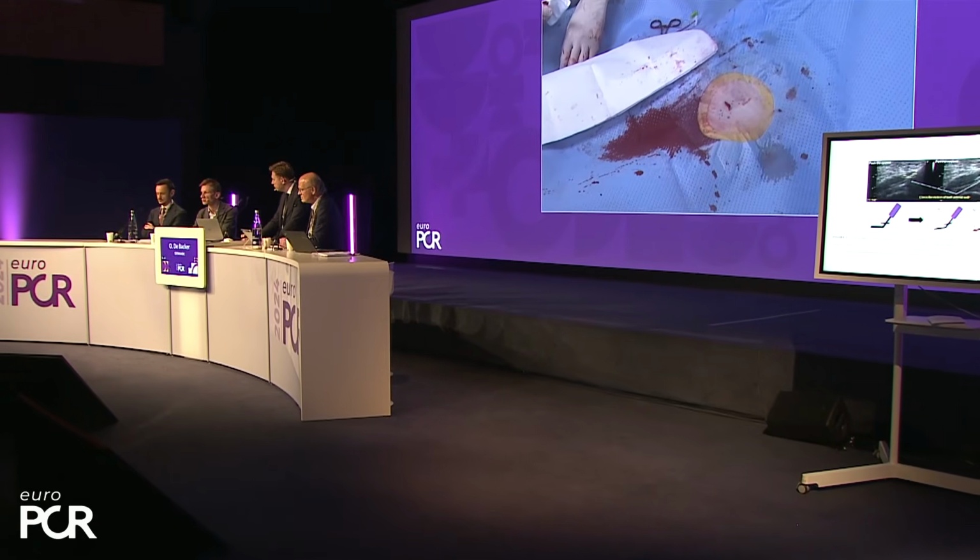So you can do your 1 or 2 ProStyle technique, as we explained. What we do in Copenhagen is that we keep a wire in, and then in order to get a control, I don't like any check from the groins from the radial. First of all, it's very cumbersome. Sometimes you see people giving minutes of fluoro to get down there because it's hard to get there. And then finally, if you're down there and you see an issue, what then to do? Very often people don't have these very long balloons or stents on very long delivery shafts. So I think it's a waste of time really to do a check from radial.